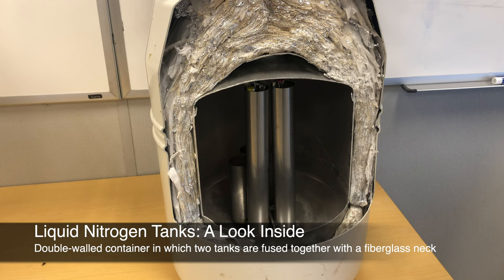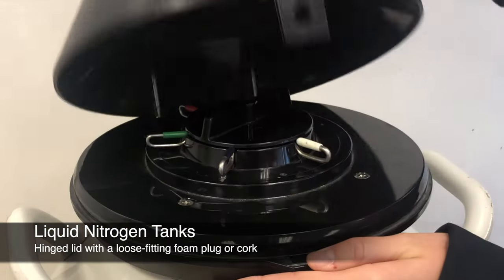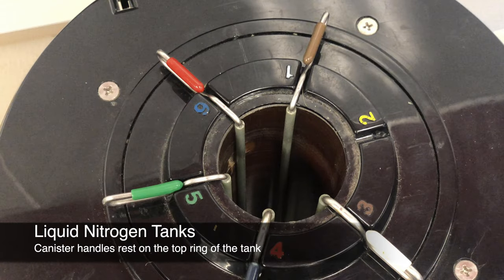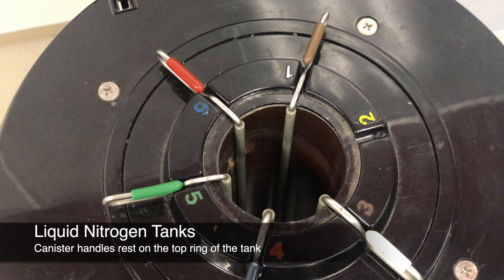A liquid nitrogen tank is a double-walled container in which two tanks are fused together with a fiberglass neck. A hinge lid covers the tank canister area, and a styrofoam cork fits loosely in the tank neck. Stainless steel canisters hold the semen canes in the tank.